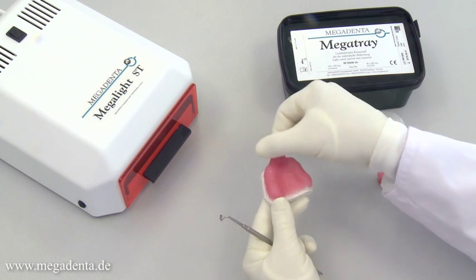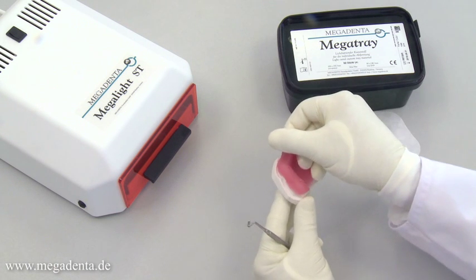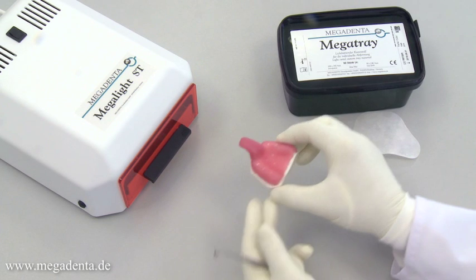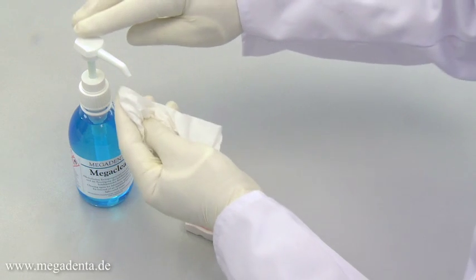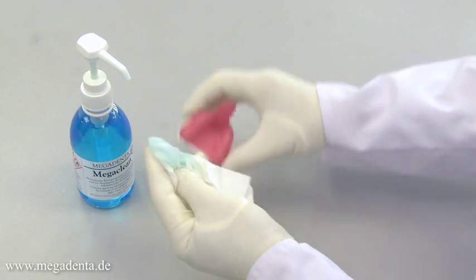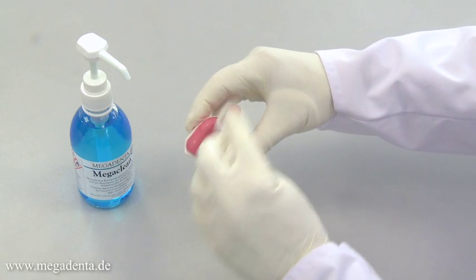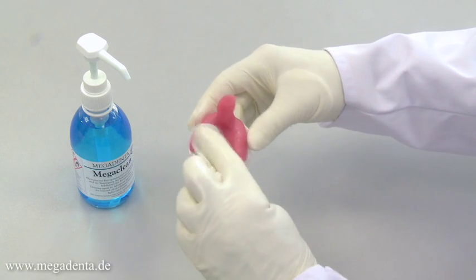Megatray has an adhesive inhibition layer on the surface after the curing process, which allows the addition of like material to add some parts or a handle to the tray. This adhesive layer can be removed with a tissue and washing up liquid or a cleaning agent like Mega Clean. The borderlines of the final tray can be smoothed using burrs, dental drills, diamond polishers, or sandpaper drills.